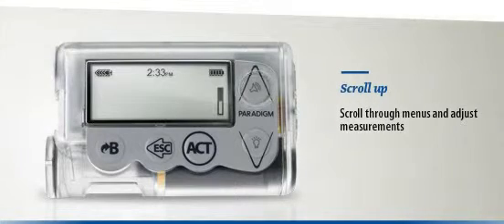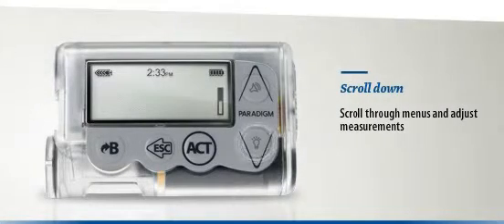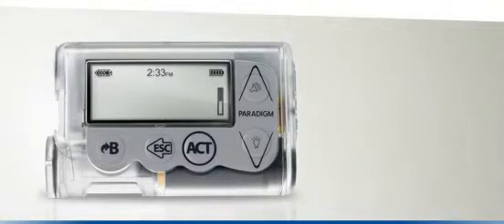And with the up and down arrows, you can scroll through your menu and submenus and also make therapy adjustments. The down arrow also allows you to activate the backlight when pressed at the same time as the bolus button. Try to familiarize yourself with these buttons now, as we will be referring to them throughout the instruction video.